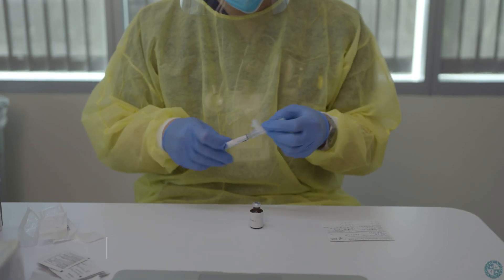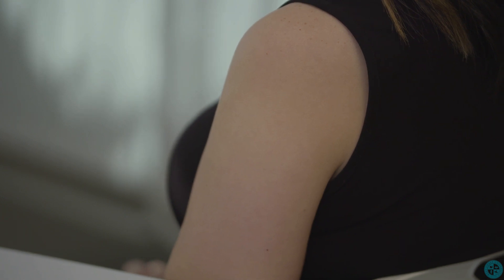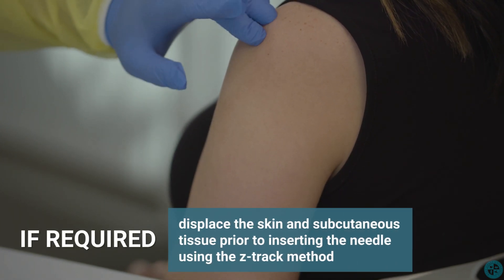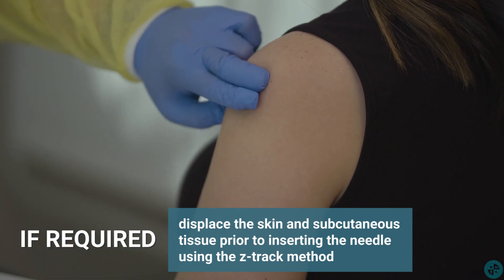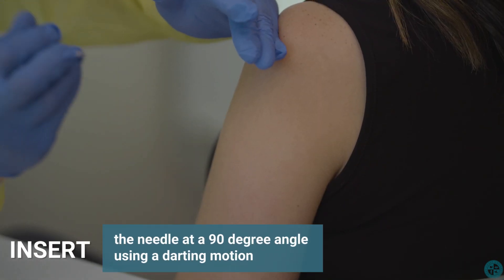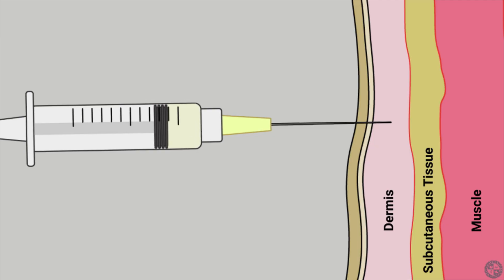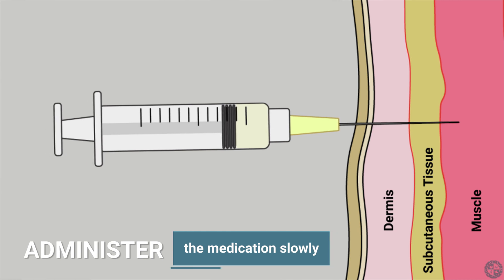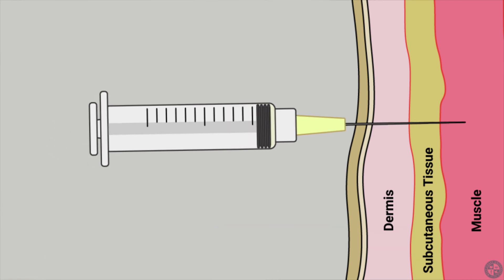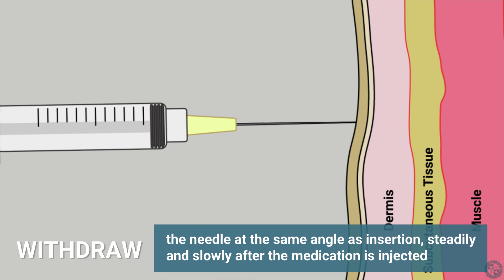Next, uncap the needle. If required, displace the skin and subcutaneous tissue prior to inserting the needle using the Z-Track method. Insert the needle at a 90-degree angle using a darting motion. Remember to administer the medication slowly. After the medication is injected, steadily and slowly withdraw the needle at the same angle as insertion.